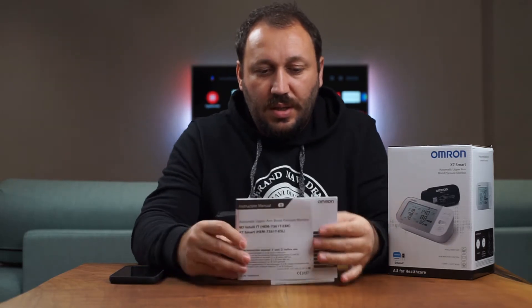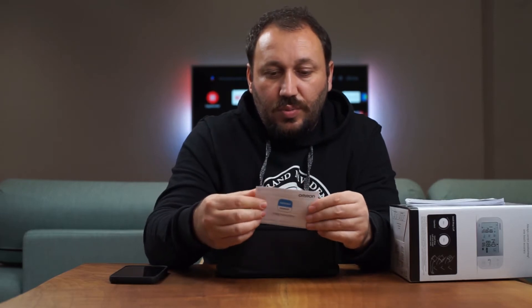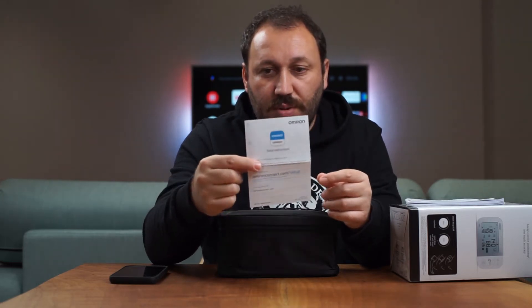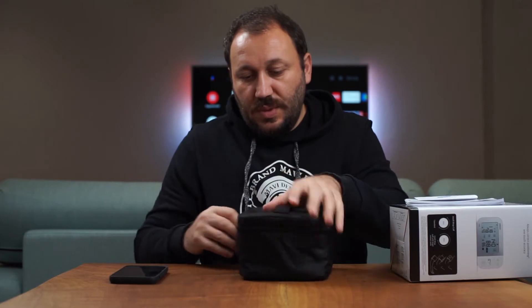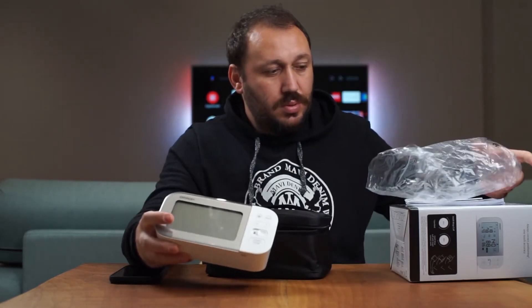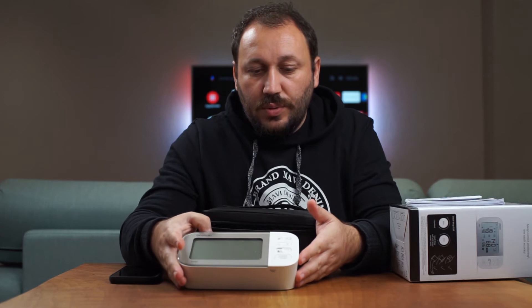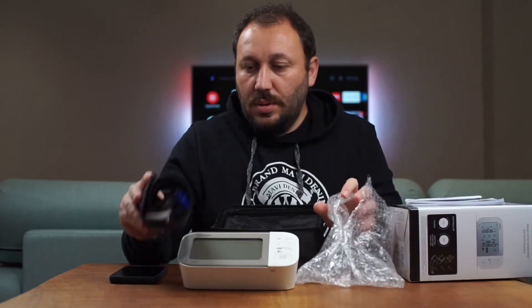Inside the box it comes with a carry bag and also some paperwork — a manual showing how to use it. It also indicates the Omron Connect app and there's a web page explaining how to set up and use it, where you can see all the details.